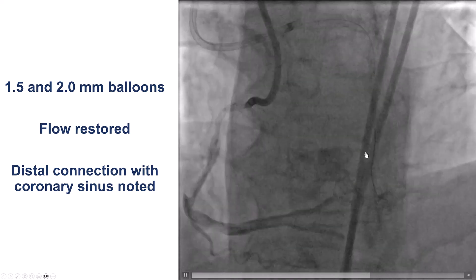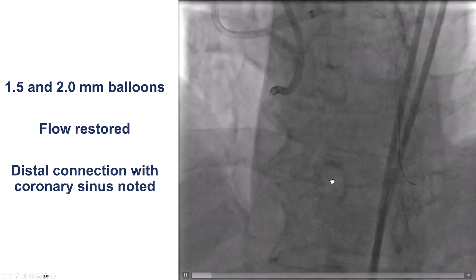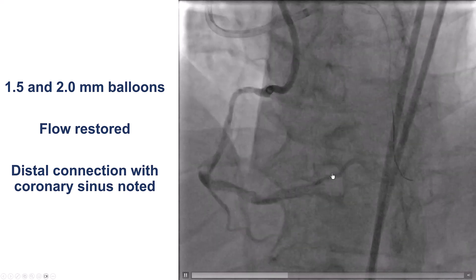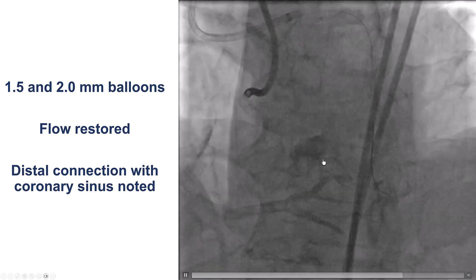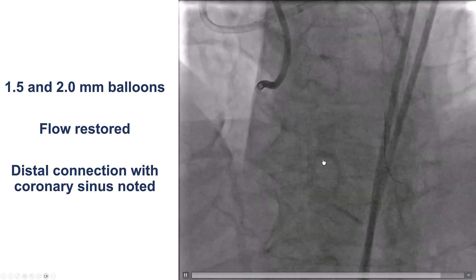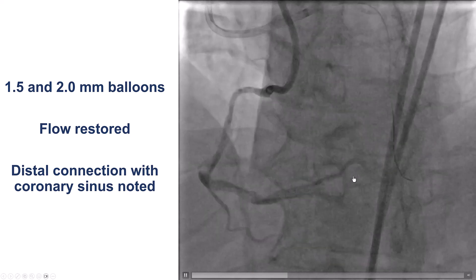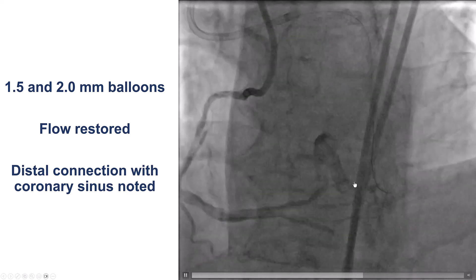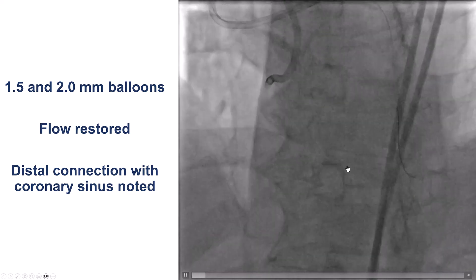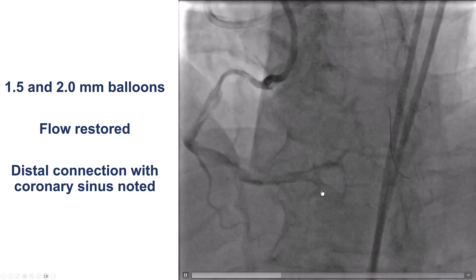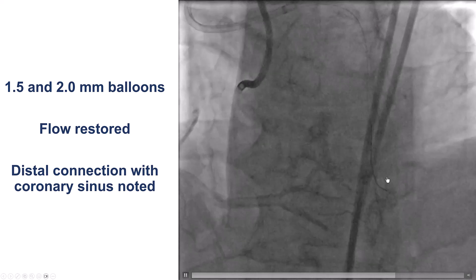However, we now observed early filling of the coronary sinus, which was of course a source of alert. Did we have a perforation? Did we need to use a covered stent or a coil? What appeared to be happening is that there was a connection created between a branch of the right posterolateral and the coronary sinus, likely from deep advancement of the knuckled Fielder XT wire.